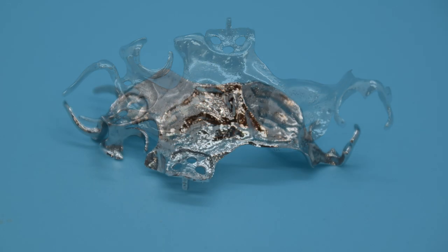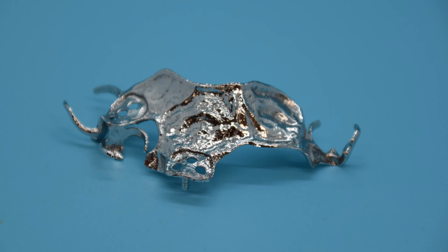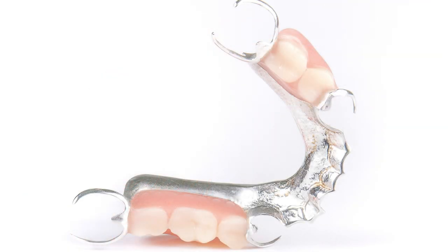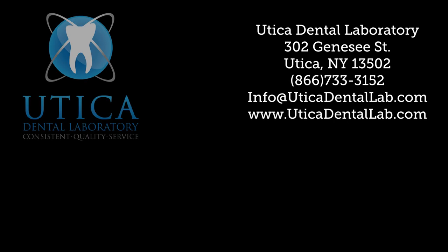3D printed metal partials finished with the electro polishing technique — never before have partial frames fit so comfortably or shine so bright. Utica Dental Lab is committed to providing our clients the most advanced and comprehensive dental technology solutions, now and in the future. Utica Dental Lab will be your preferred digital dental laboratory.